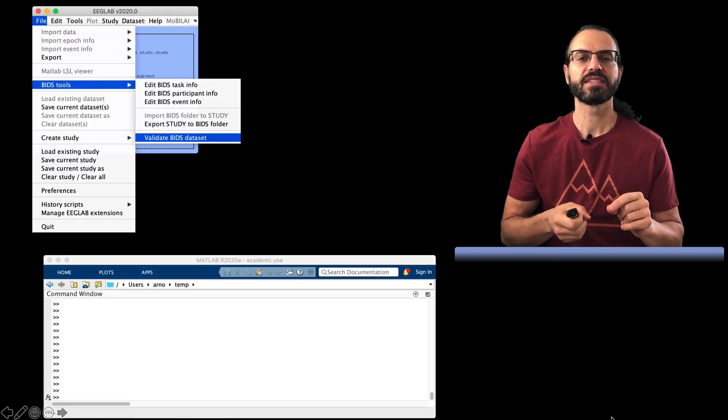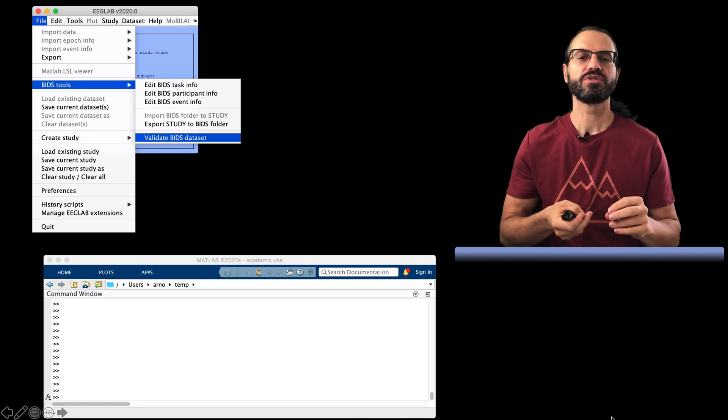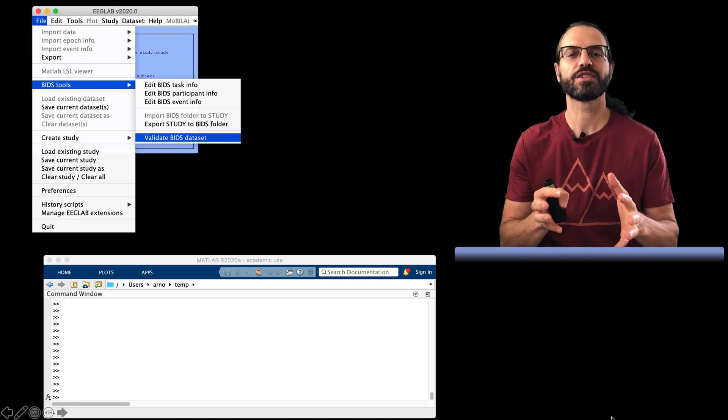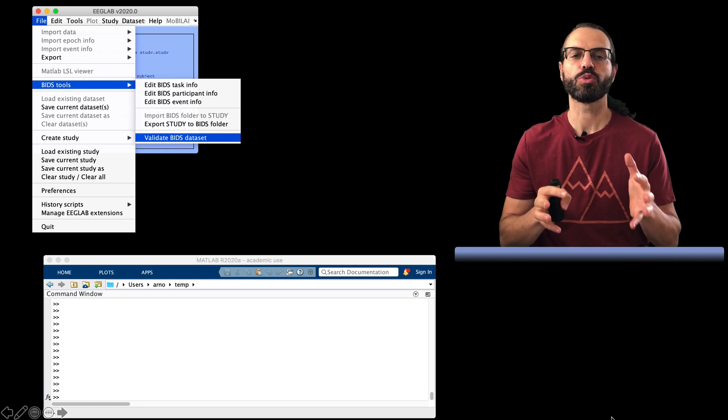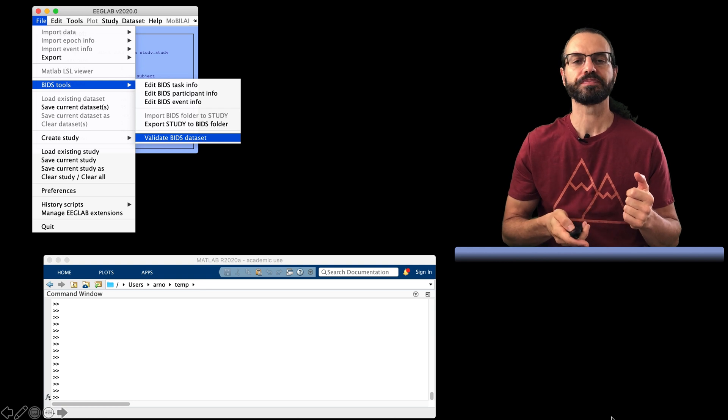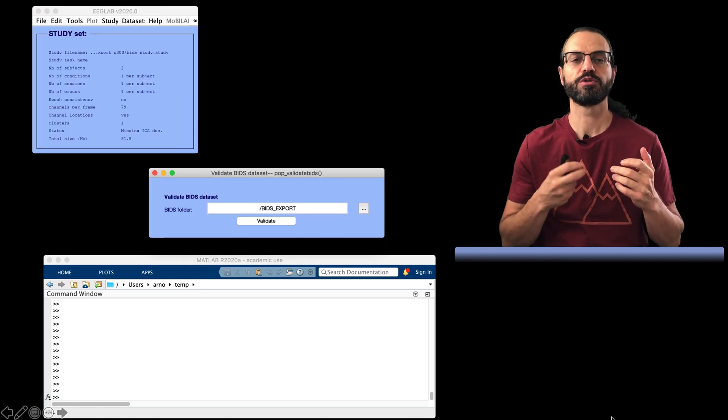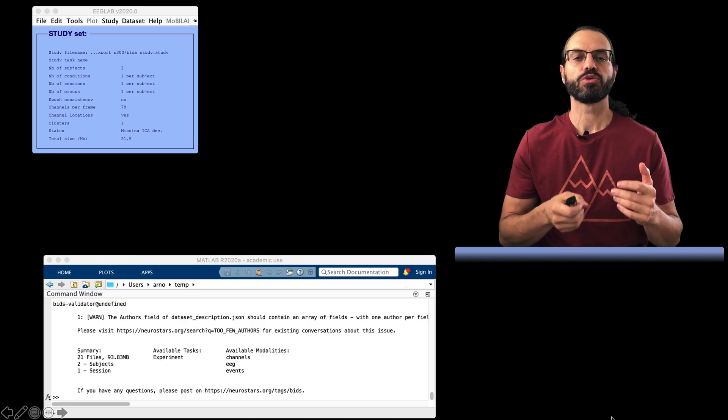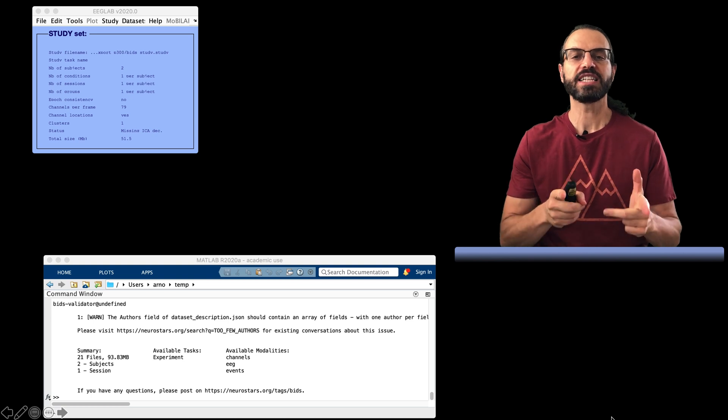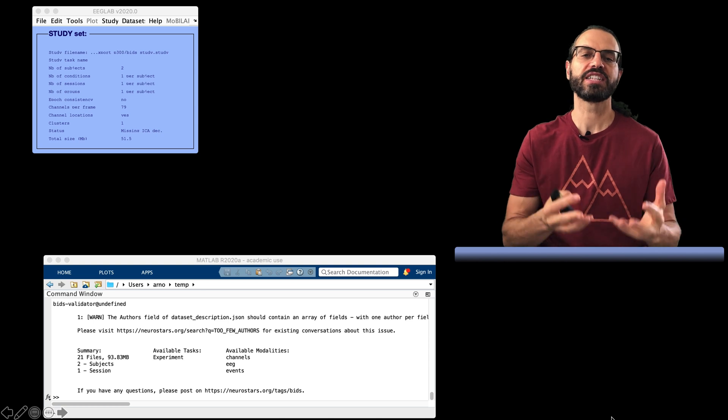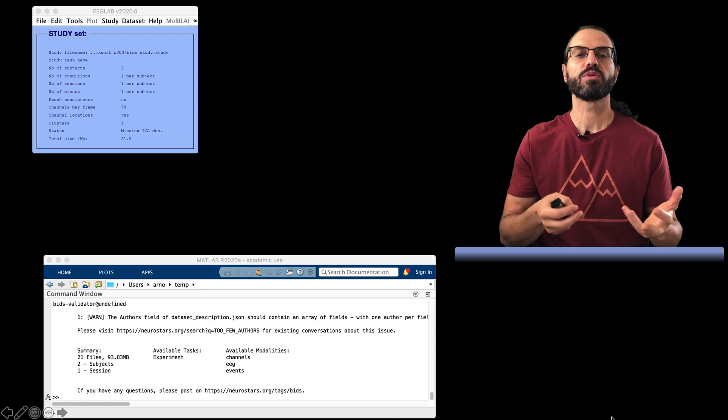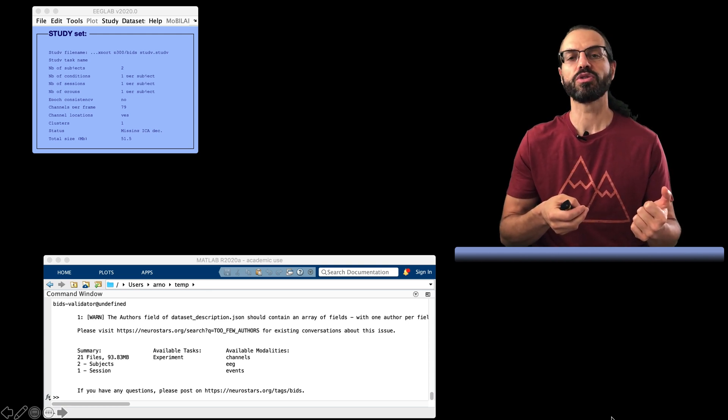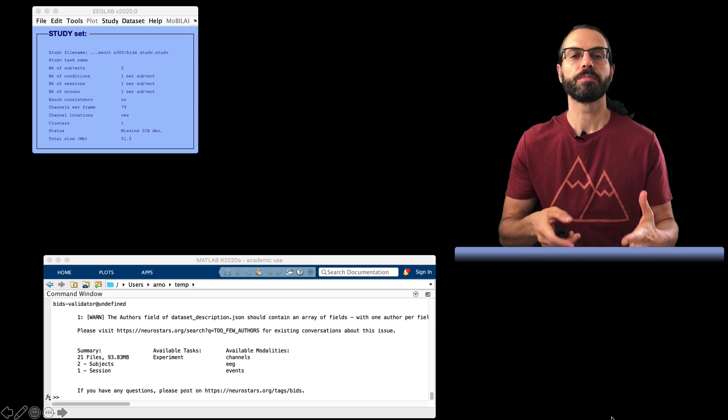The next step is to check that your data is BIDS compliant. Since you use the EEGLAB plugin to export it, it should always be BIDS compliant, so there will likely not be any error. However, sometimes there are warnings. So this is the menu to call the BIDS validator. It simply asks you for a folder to validate. Once you press OK, it prints a report on the MATLAB command line. In this case, there is a warning message because there is only one author for a study and the BIDS validator judges that this might be an omission. So now we're ready to go to a data repository such as OpenNeuro, log in with your Google account, and upload your BIDS folder. So it's that simple.